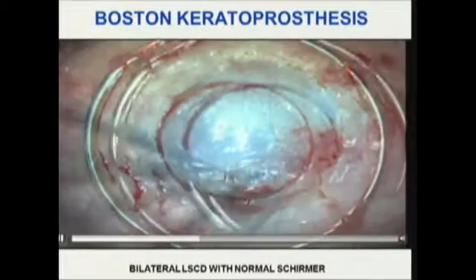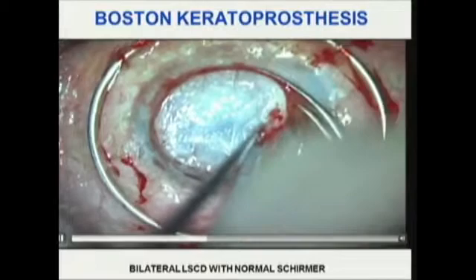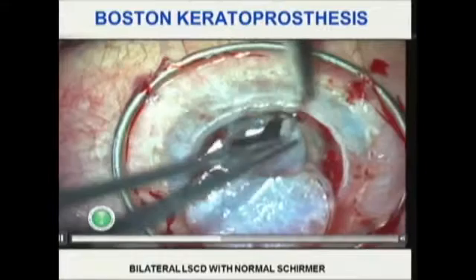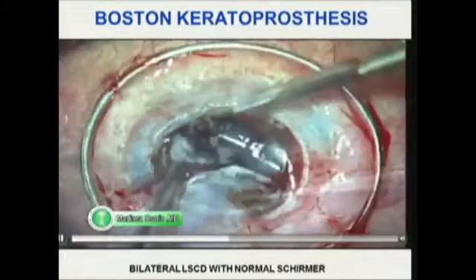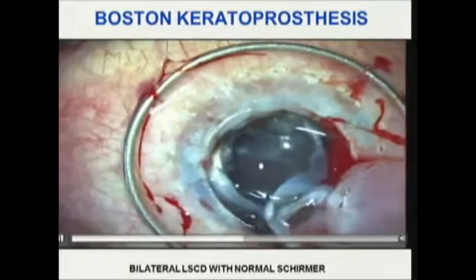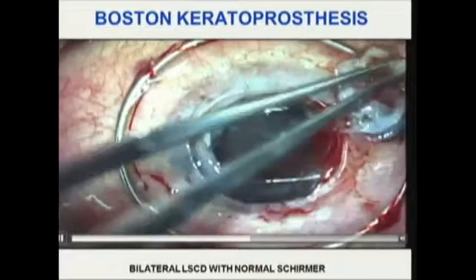The button was excised with corneal scissors, and in this patient you can see that a thick retrocorneal membrane was also excised. It's really important to remove all of it in the anterior segment in order to improve the outcome, when the patient has a retrocorneal, retrolental membrane. After that, we remove the IOL.